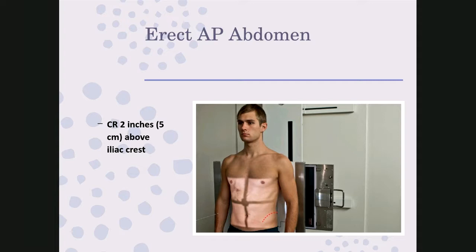But the patient is able to stand upright for this, whereas in the last image, the patient was probably not likely able to stand. So this would also demonstrate any abnormal masses. It would demonstrate air fluid levels, and accumulations of intraperitoneal air under the diaphragm.